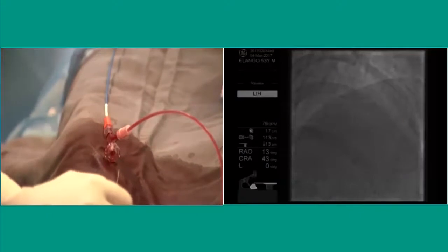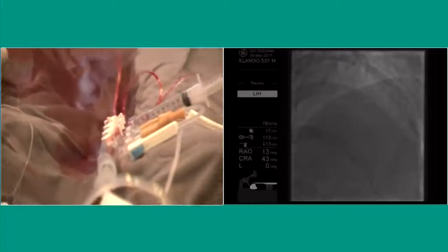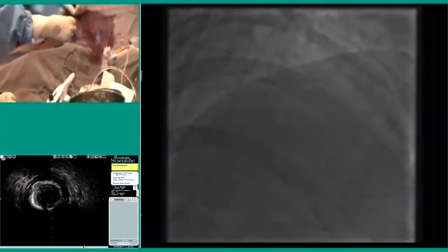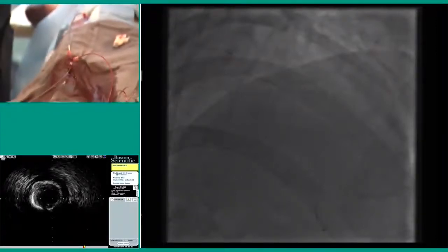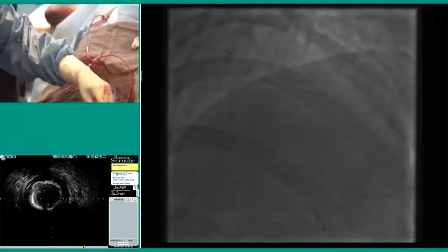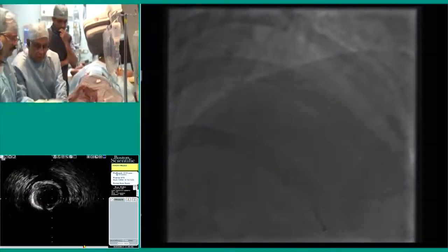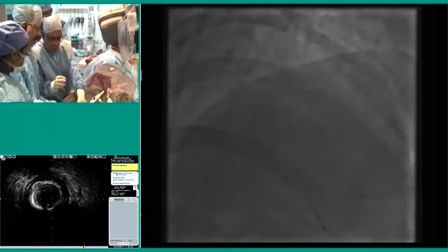It's the newer burrs that are coming. The earlier ones were fixed. Yeah, I know, but that's the only change. In everything else, things have improved a lot. And they were better sterilizable than these ones. That's all. And of course, our techniques have changed slightly. Yeah, it's more the learning which has improved. Also remember those were standalone days. We were doing it in lieu of other technologies, and now we just use it as an adjunctive tool, and that's a difference.